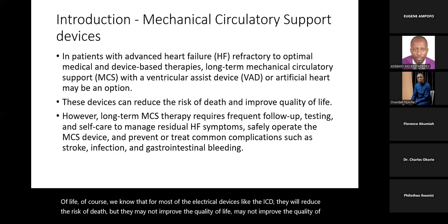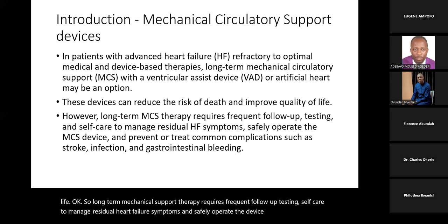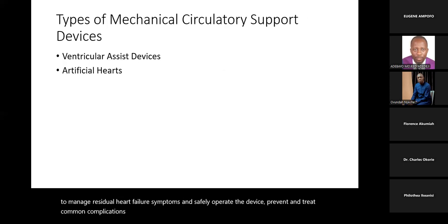Okay, so long-term mechanical support therapy requires frequent follow-up testing, and self-care to manage residual heart failure symptoms, safely operate the device, and prevent and treat common complications. These are the two types. Our focus today is on ventricular assist devices, but you could also have artificial hearts.